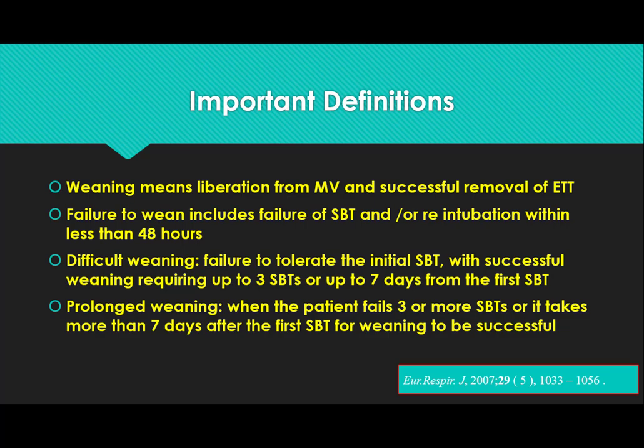We're supposed not to take more than one or two spontaneous breathing trials, and it shouldn't take these days. If you require more than 3 attempts and more than 7 days, this indicates that the process is very prolonged, and there are many reasons for it. The management has to be very different, and will change dramatically if you are dealing with a prolonged weaning process.